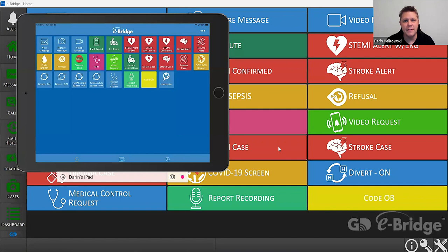Hey everybody, this is Darren from General Devices. Today I want to show you how easy it is to use our eBridge solution to send an alert such as a Code OB from someplace like the emergency department up to the labor and delivery floor.